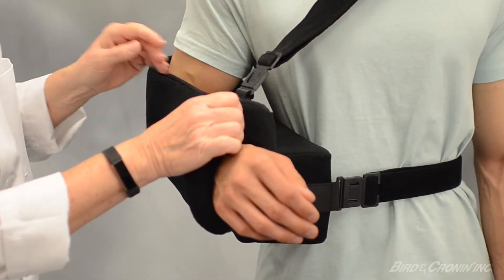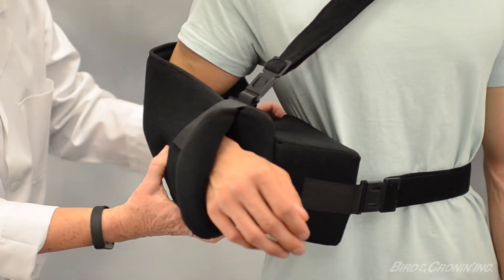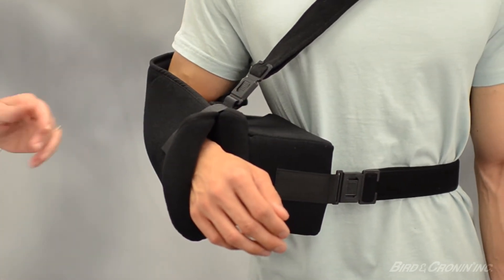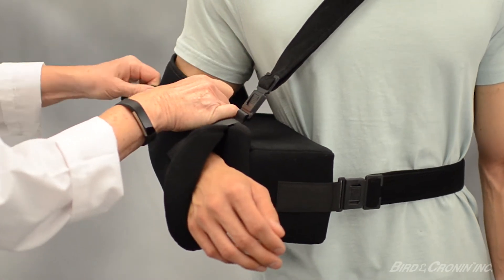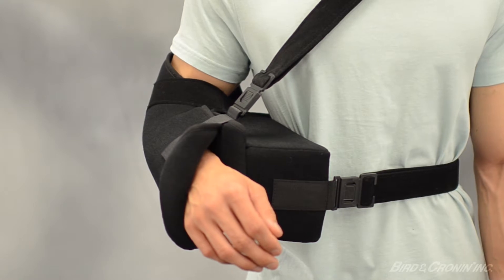Press and secure the sling pouch to the hook strip located on the outside of the abduction pillow. Use one of the 1.5 inch hook straps to secure the patient's elbow in the arm sling. This will prevent the arm from sliding forward and secure the arm in the sling pouch.